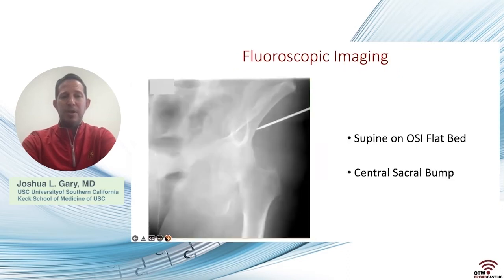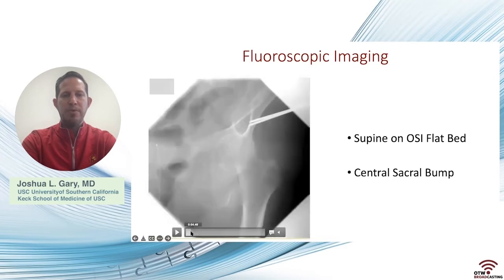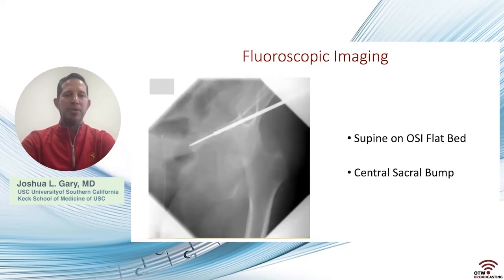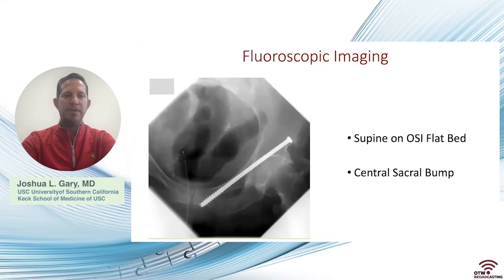And so, I would say before we saw this implant that can actually perform in 4 dimensions, you really didn't have a pathway to get all the way across. And so here I started up at the front of her ring just because it was non-displaced and I did want to add stability. My starting point was a little too low, so I just then adjusted the starting point a little bit more cranial and used a more standard 7.3 millimeter screw at the left hemipelvis.